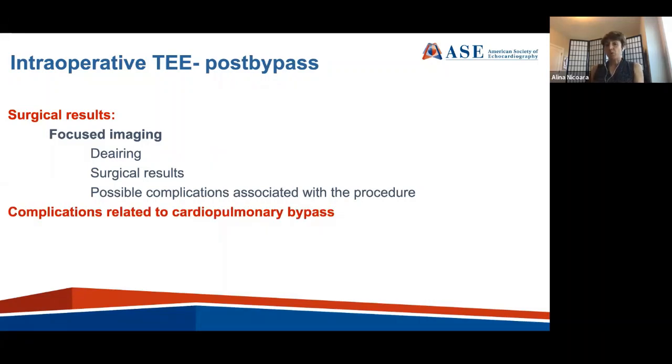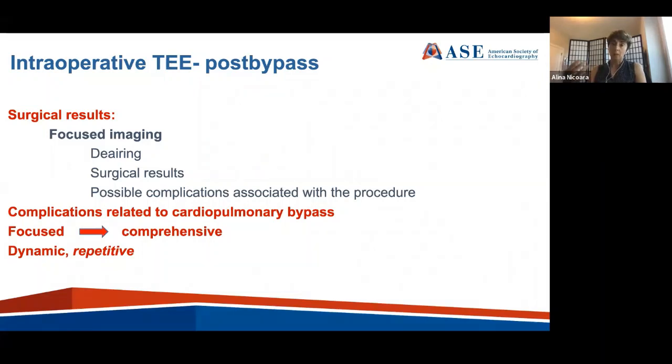We can also, and we should also, assess post-bypass for complications related to cardiopulmonary bypass. And as Nick has stated before, the exam starts as being focused, looking at surgical results and possible complications associated with the procedure, but as the post-bypass period progresses, it should become comprehensive. It's quite dynamic. The hemodynamic conditions can change, and it should be repetitive. It's a tool that we have literally at our fingertips throughout the post-bypass time.